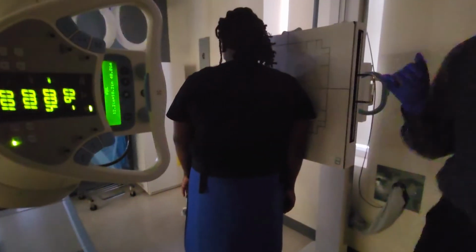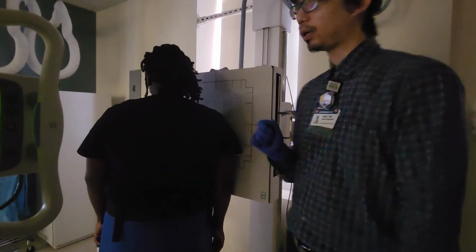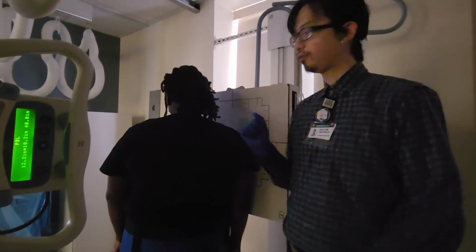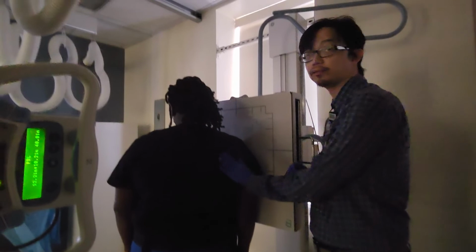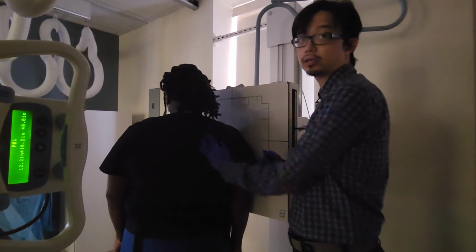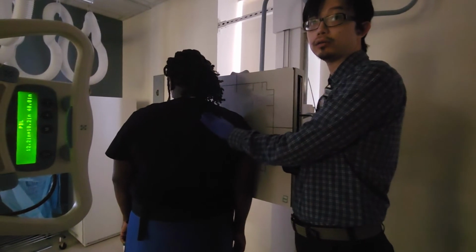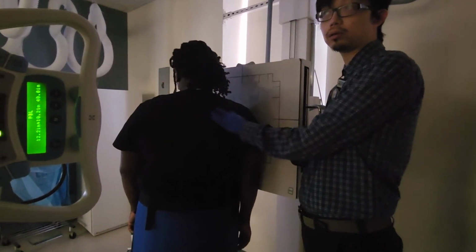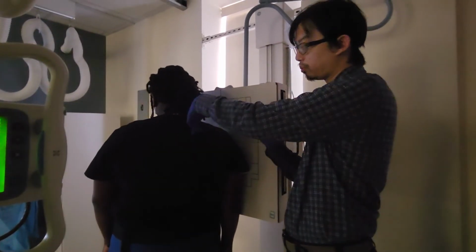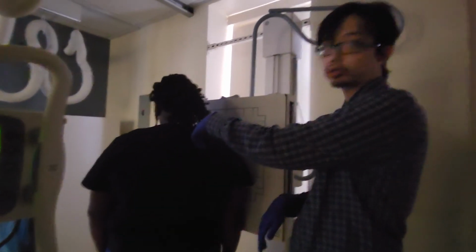All right, so let's talk about the toughest part of the Y view. How do you get a proper oblique? The idea is that you need to superimpose your medial border and your lateral border. How do you find your medial border? Well, you can palpate for it. I can look for the scapula and I can feel the medial border right here. So for the medial border, I'm going to go all the way up and use the superior angle as my point to represent the medial border. So this is the medial part of my scapula.